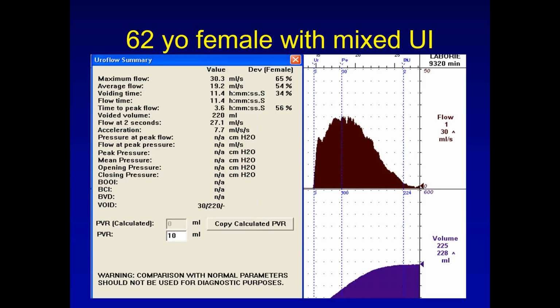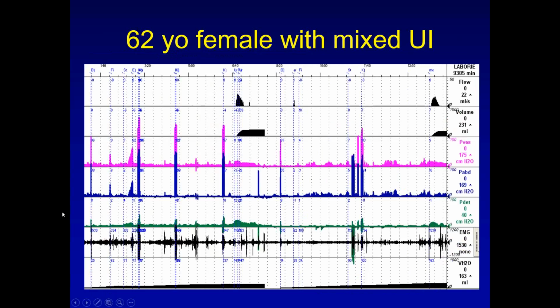So here we see she holds 163 at the most. This is 2 separate runs again. Here she's got 147 capacity. Her first sensation was 62, much too early.